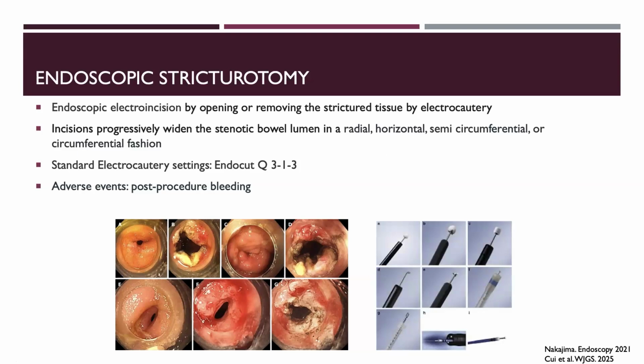So going into the submucosal muscular space, because you want to be able to know how to use these knives and want to know when to stop cutting. We don't want to ever cut all the way through muscle. We don't ever want to cut to see serosa, because you can easily perforate. Again, the risk of perforation here is technically low because these are done in places with high experience.